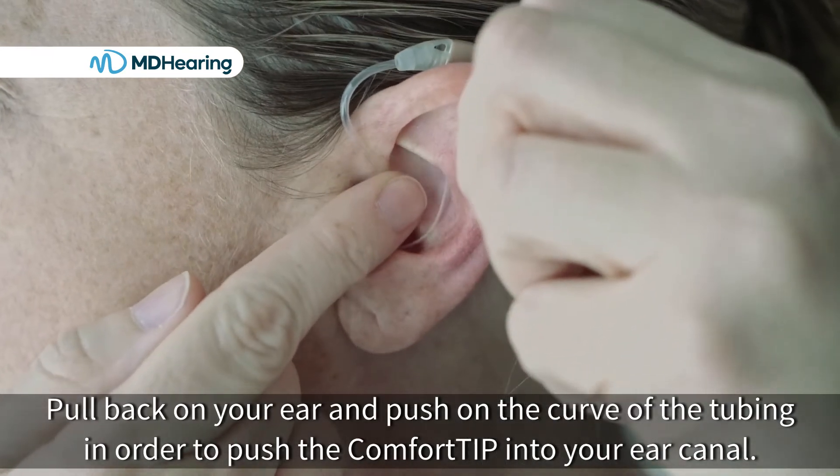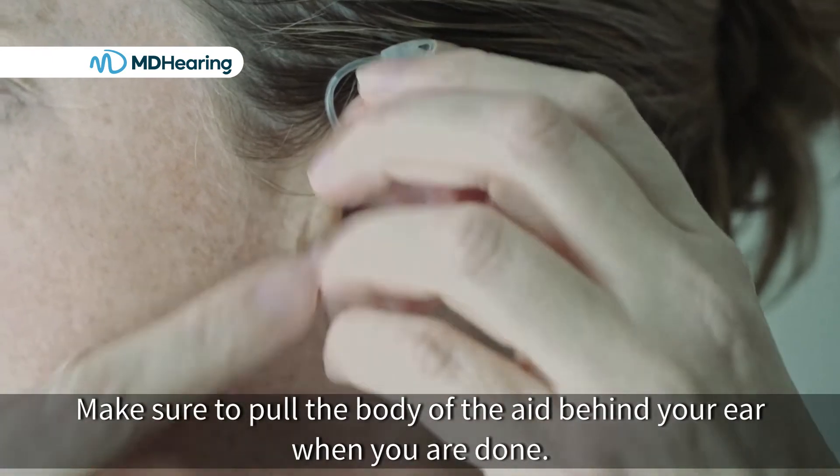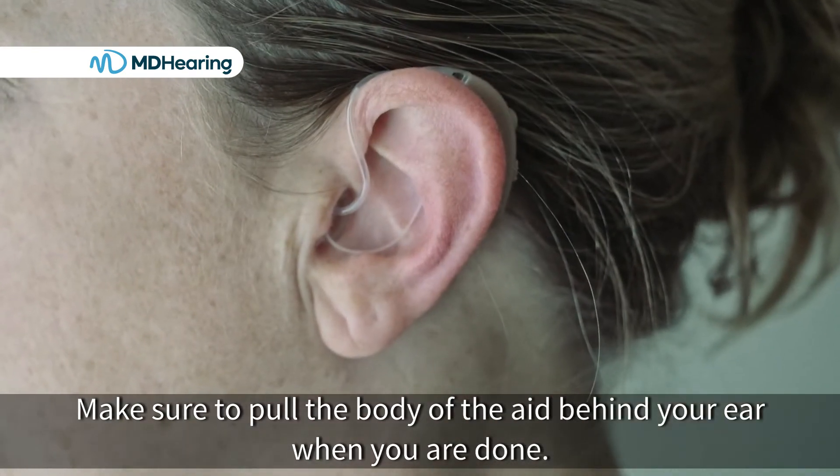Pull back on your ear and push on the curve of the tubing in order to push the comfort tip into your ear canal. Make sure to pull the body of the aid behind your ear when you are done.